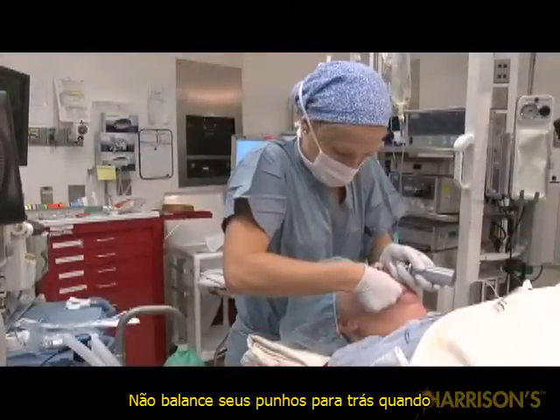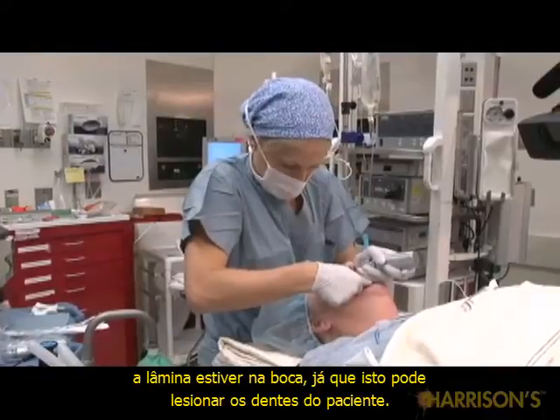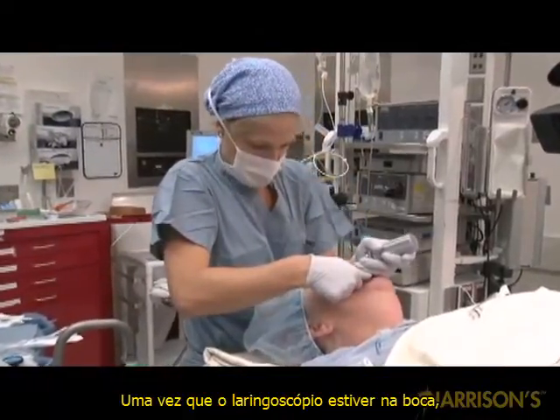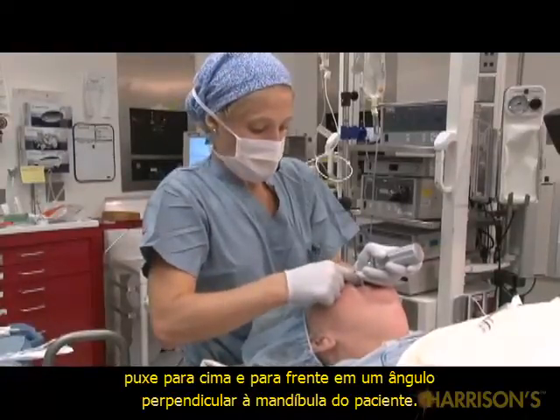Do not rock your wrist back when the blade is in the mouth, as this may injure the patient's teeth. Instead, once the laryngoscope is in the mouth, pull up and forward at an angle perpendicular to the patient's mandible.